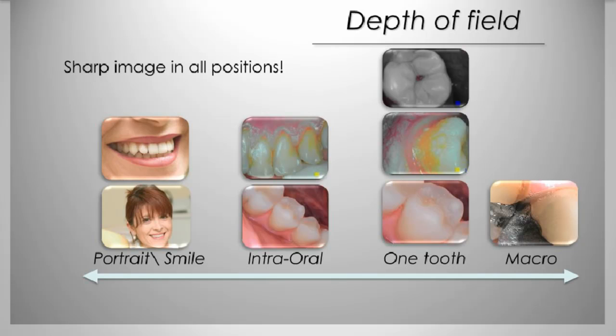And the other photo here where it's the smile, I think this is very important for smile makeovers. Dentists who are doing Botox injections and things like that to get the full look and the way that the lips are positioned around the teeth and so forth, and for periodontists for periodontal plastic surgery. So this is a really valuable portion of the intraoral camera.